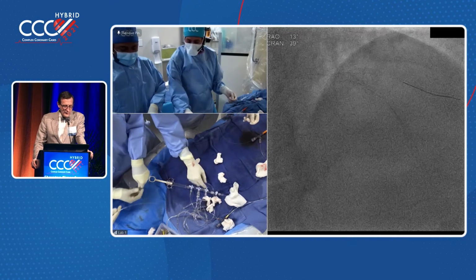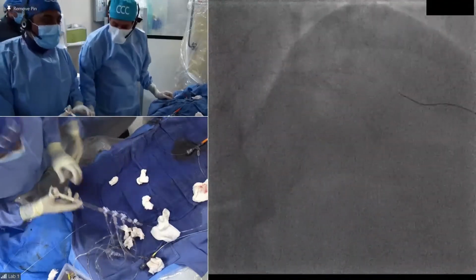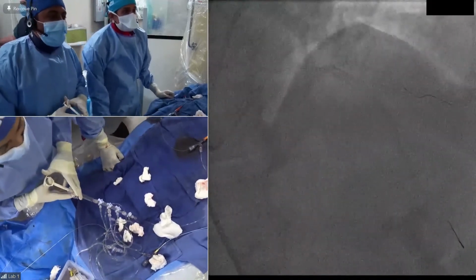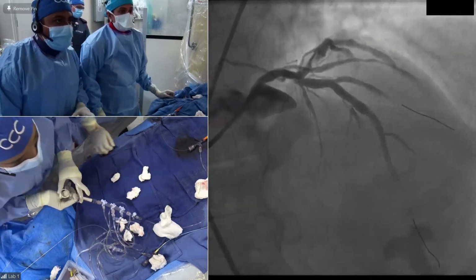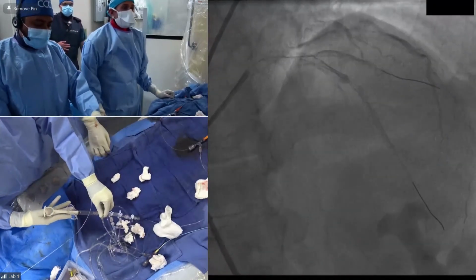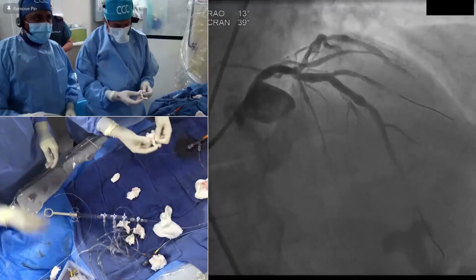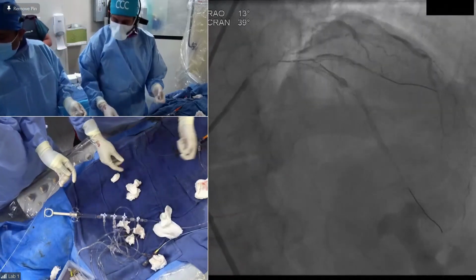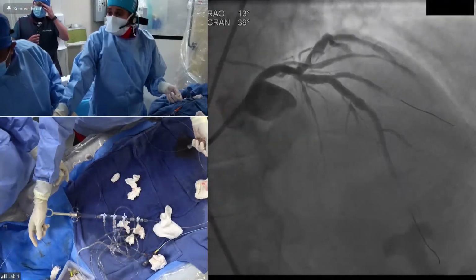Let's show you the final picture before you leave. All we have to do is kiss now, but let's show you a final picture. One injection. We see the distal vessel, how it looks now after all the steps. It's going to even look better. That's how it's going to look. Fantastic. You see a nice distal LAD. I think with vasodilators, it will get better. A little bit of nitro will help. You want to do the high pressure kissing balloon, and then the flow is going to get better. Things are going to look great.